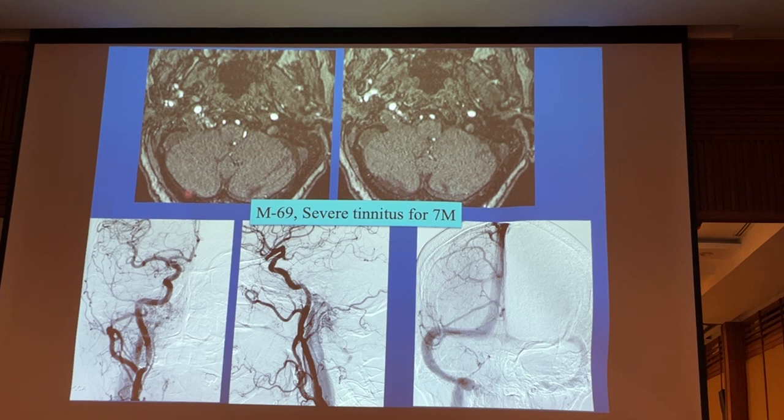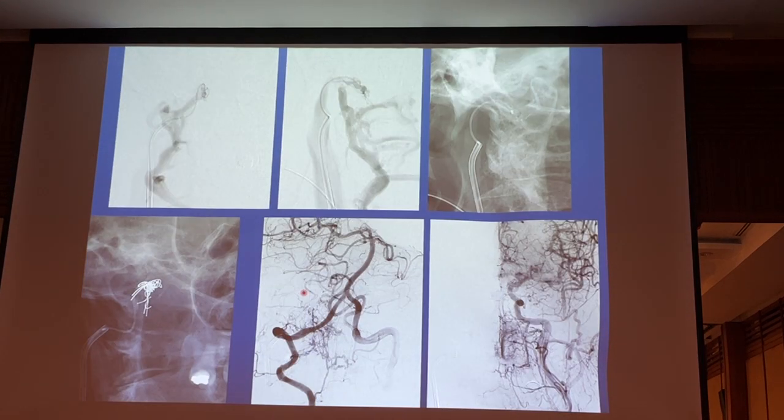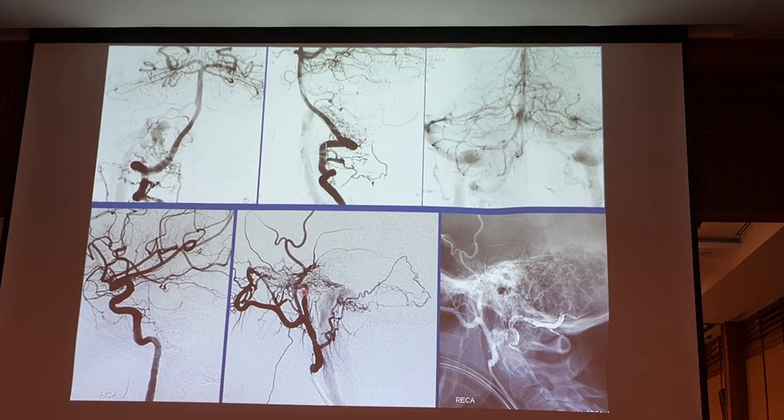This is more of, I think, hypoglossal. Is it jugular? Maybe jugular fossa. Okay, this supply was coming from occipital and ascending pharyngeal. No, this is hypoglossal, I'm sorry. Okay. This lesion was treated with transvenous approaches. Okay, this was successfully closed.